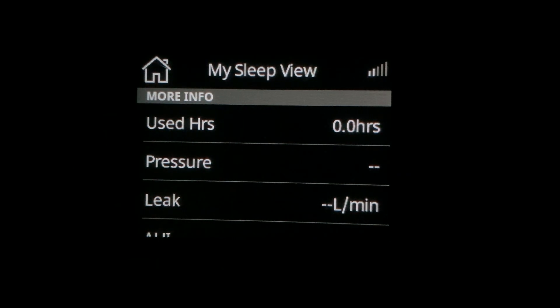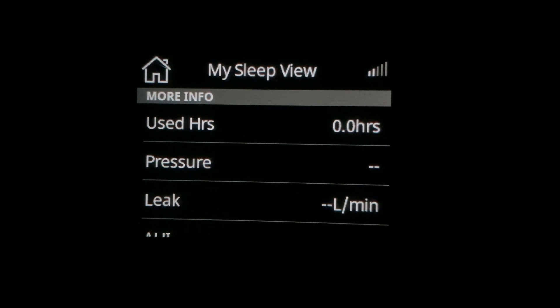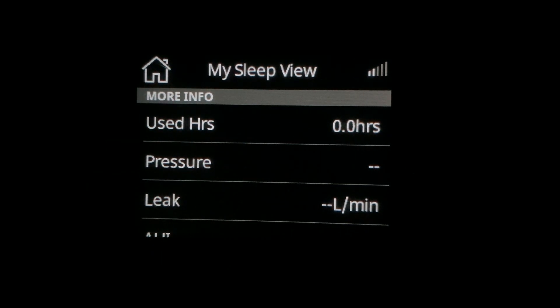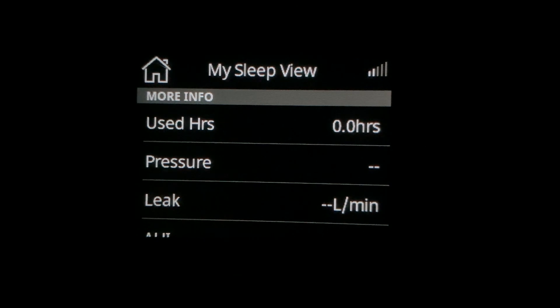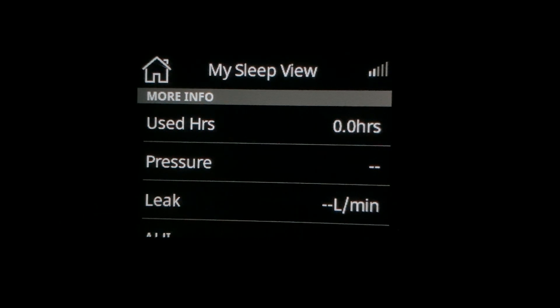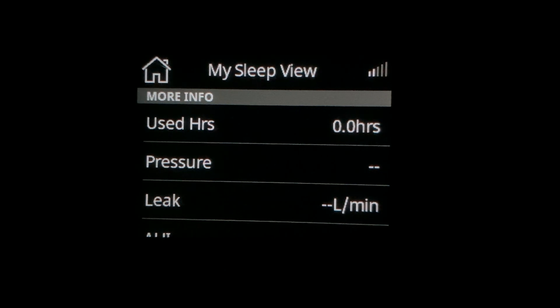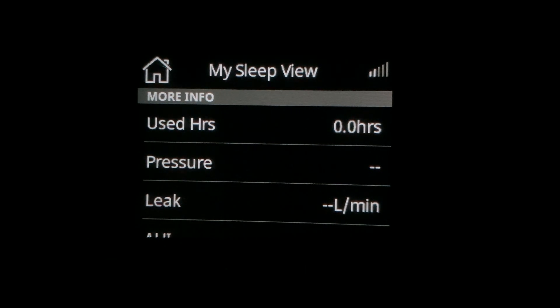But if we can, we're going to work towards getting that number below 24 because it tends to help people have less dryness, have less nasal symptoms such as sneezing, congestion, or irritation, and may even help them keep their mask on better at night if they're tending to leak, wake themselves up, and take the mask off during the night.